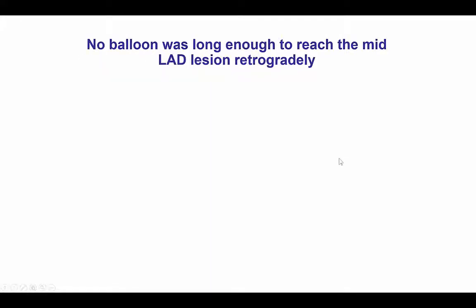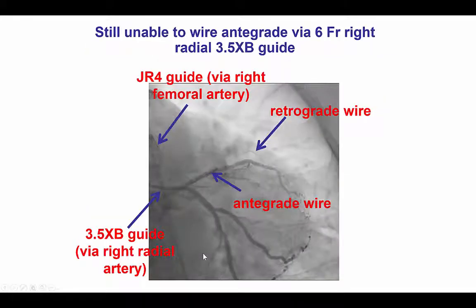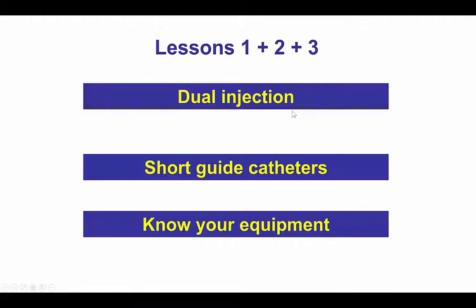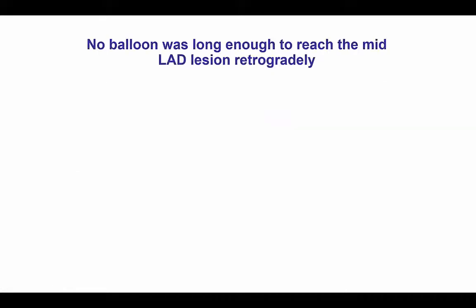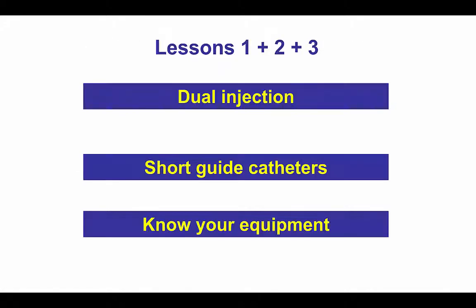Our initial plan was to get a retrograde balloon, balloon the mid-LAD, and then use another wire to wire the lesion antegrade. However, we soon found out that we could not advance a balloon all the way to the lesion. Therefore, there are multiple lessons already: one is that dual injection is key for CTO intervention; second, that short guide catheters and long microcatheters should be used when the retrograde approach is being planned.